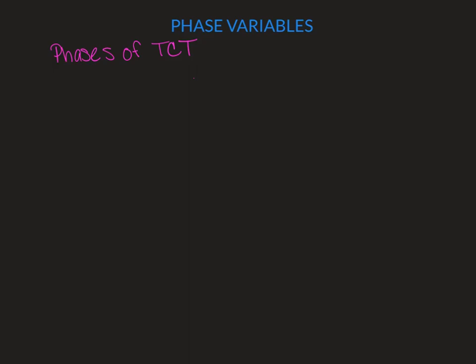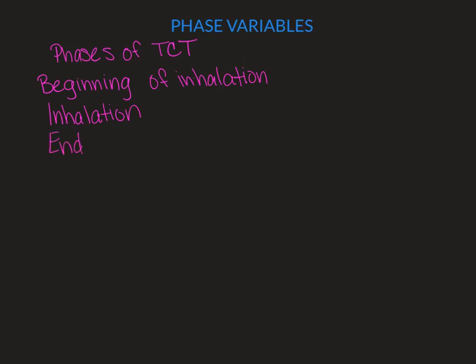You have the beginning of inhalation, inhalation, end inhalation, and then exhalation.